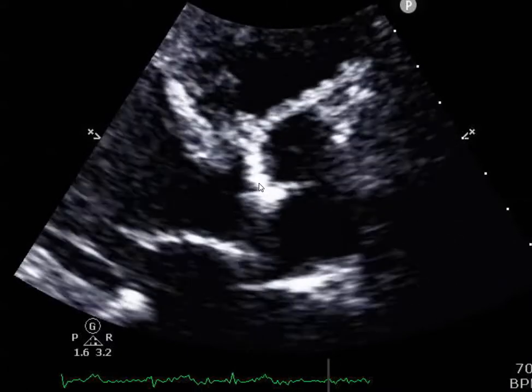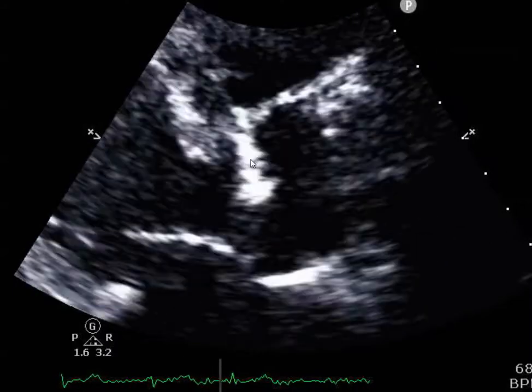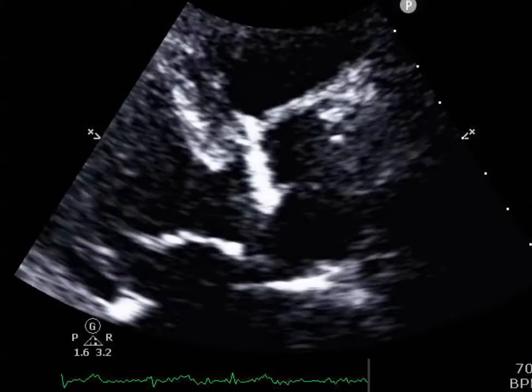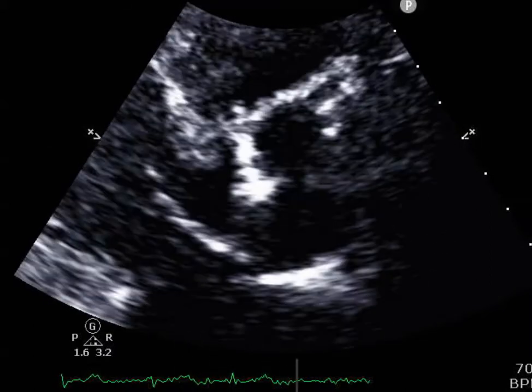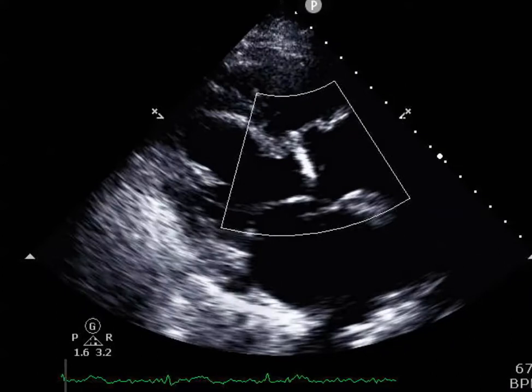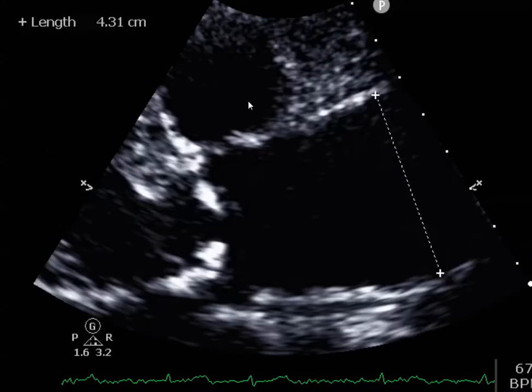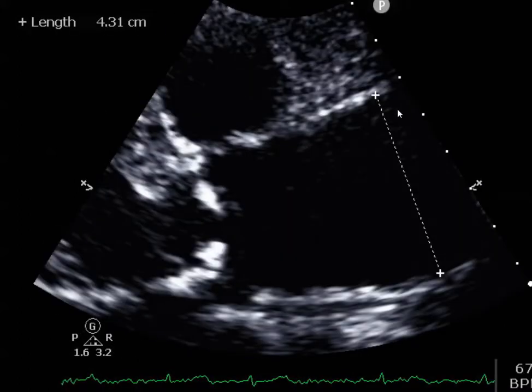Opening but barely, and there is some systolic doming. What's also interesting and helps with the diagnosis is that the aortic root is really big, about 43 millimeters, and there appears to be effacement of the sinotubular junction. So the doming of the aortic valve, large aortic root, and effacement of the sinotubular junction makes you think that there's a bicuspid valve.